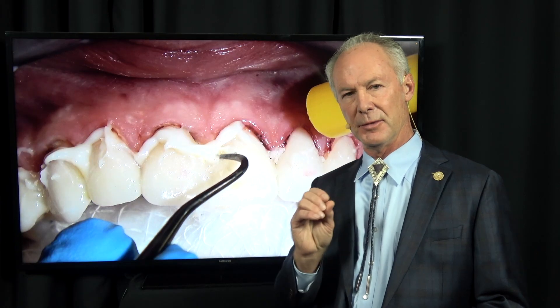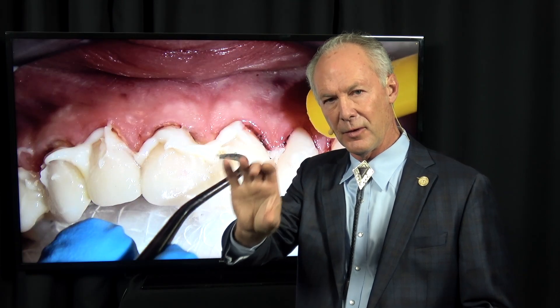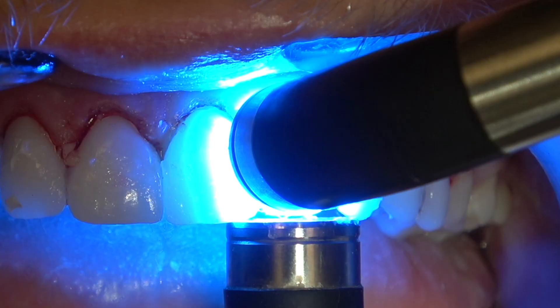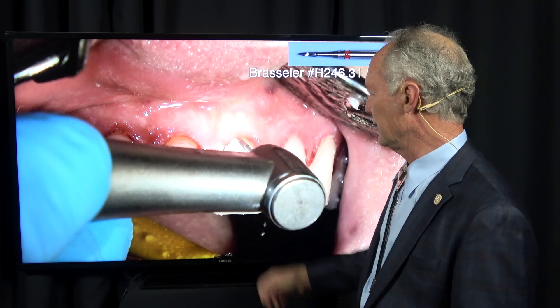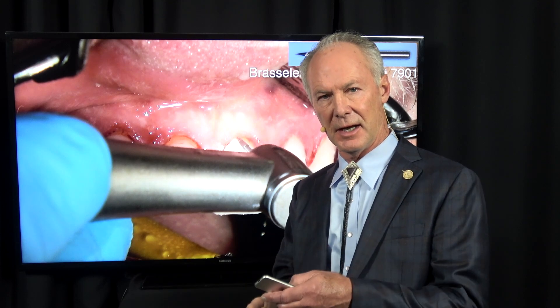If you do this, that micro gap between the veneer and the tooth is like a sandwich with the luting composite being the lettuce, the meat, the tomato, and cheese — it's filled. There's no void between the veneer and the tooth; it's filled completely with the luting composite, and the excess just chips right off. Once you've removed the excess luting composite, floss between the veneers, then cure the veneers 60 seconds on each side, both facial and palatal — that's after removing most of the luting composite with the back edge of a scaler.